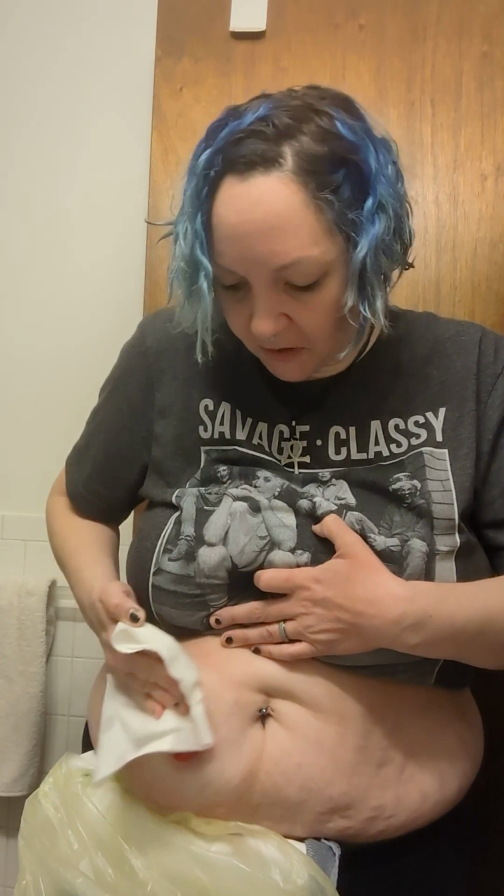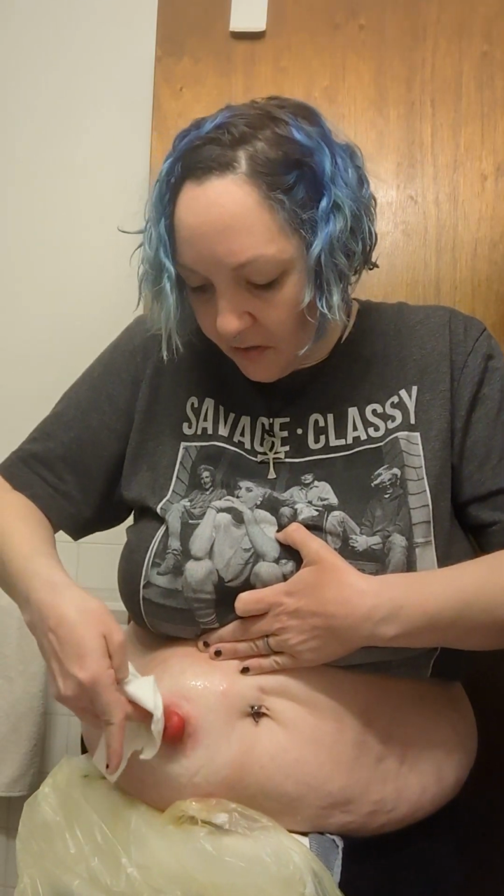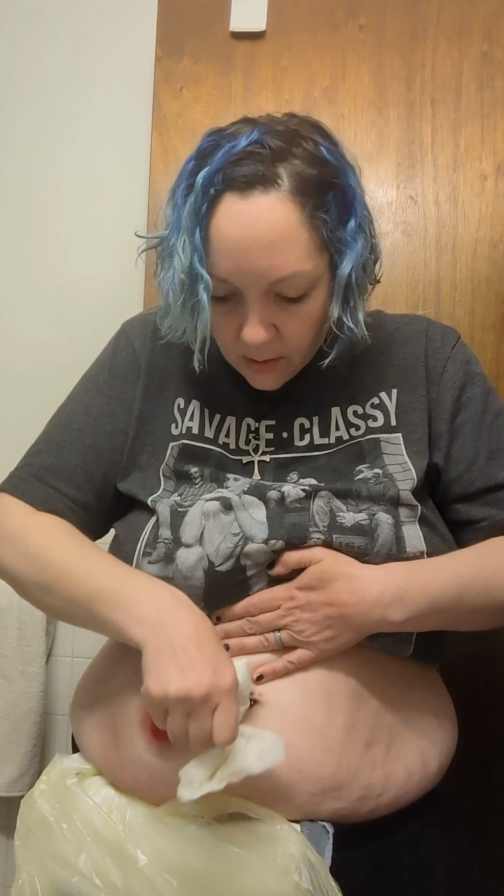Soap and water time. Alright, so now I'm just washing off my skin. If you notice, the skin is kind of lumped forward and it does hump out. It's strange. But if that's what it takes for me to be alive, I have no problem with being strange. Changes are dangerous when it's active. Leaking, it sucks.